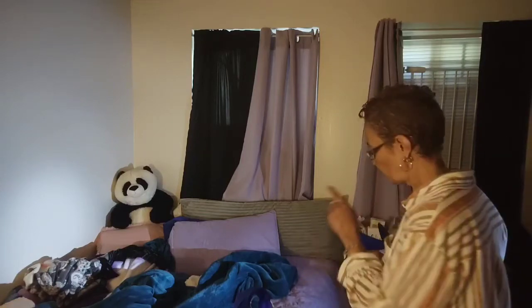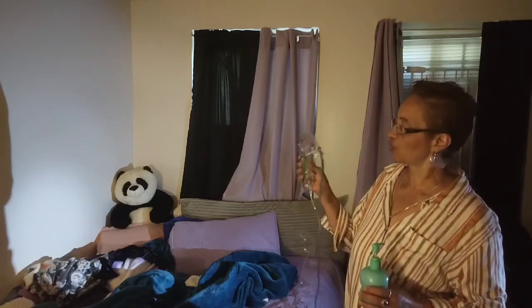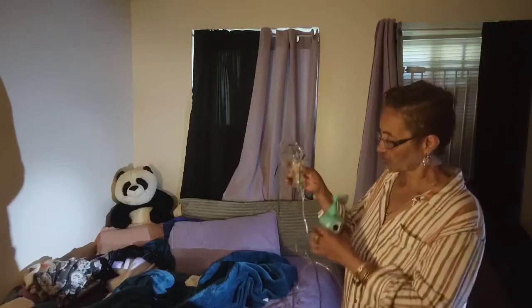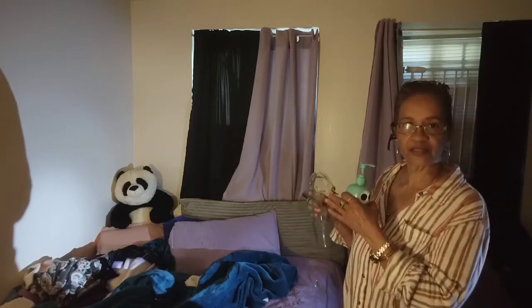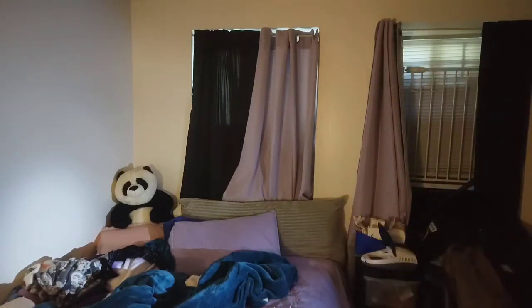If you use the same face mask, okay? If you use, just say face mask, you're the one that uses it. When you finish using it, you wipe it down with alcohol, okay? You disconnect it, you wash where you put your liquids in. And as far as the mask, you take a baby wipe, okay? So now you know that. You take a baby wipe and you wipe the, and my daughter has some here, but those are Clorox, so I don't want that one.